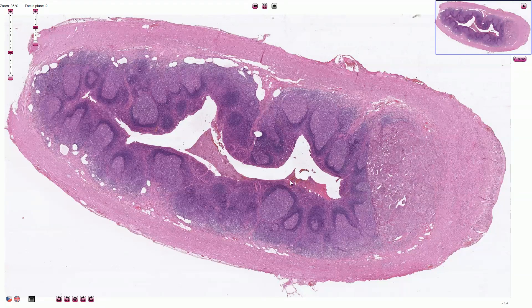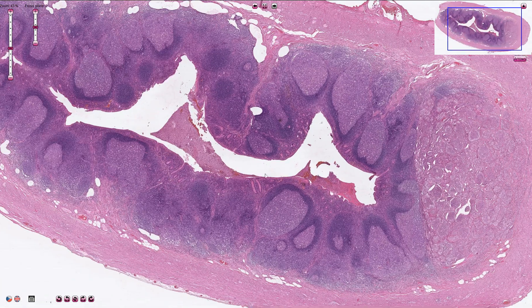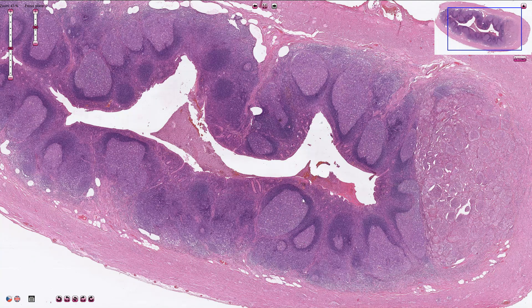This is the lumen of the appendix. Here we can see the epithelium on the top with crypts, with mucosa, with quite prominent mucosa-associated lymphoid tissue with activated germinal centers.